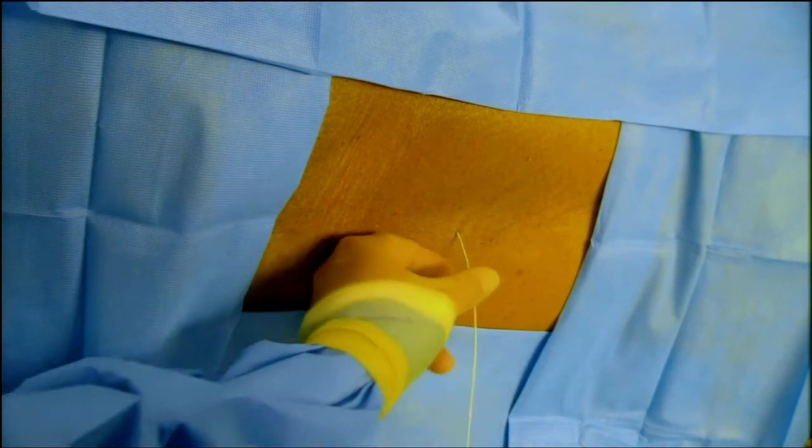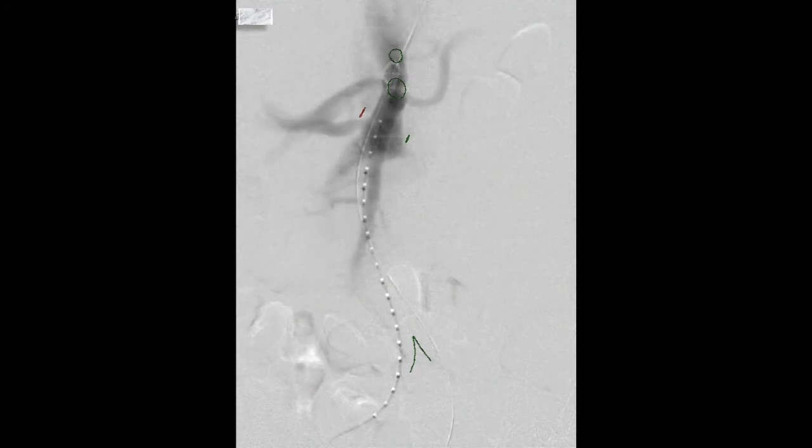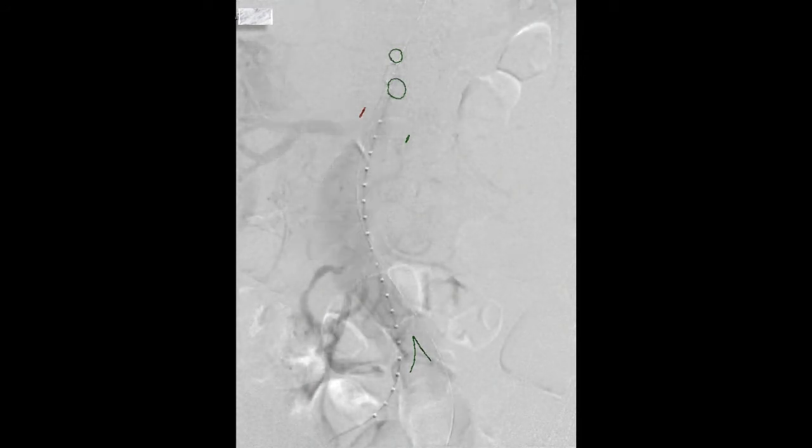The spinal drain worked well and was continued throughout the perioperative period. We performed image fusion; the marks from the image fusion represent, from top to bottom, the celiac, SMA, right renal artery, and left renal artery. These were marked by fusing the preoperative CT scan on top of the patient — in this case using DynaCT. The arteriogram confirmed the adequacy of these markings, though slightly off on the right renal. The fusion can be modified once stiff wires are in place to correct any abnormalities.